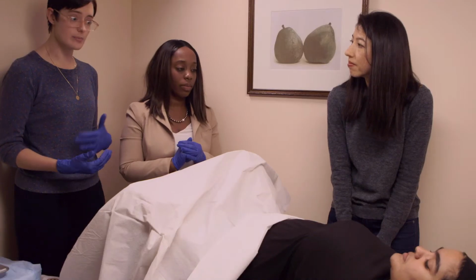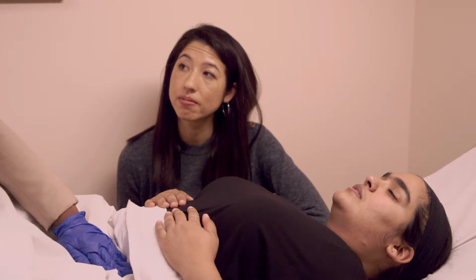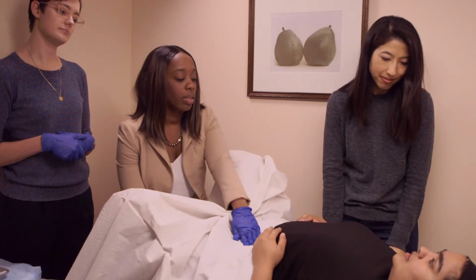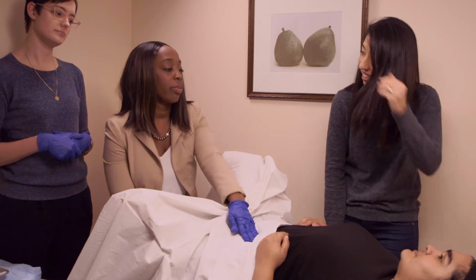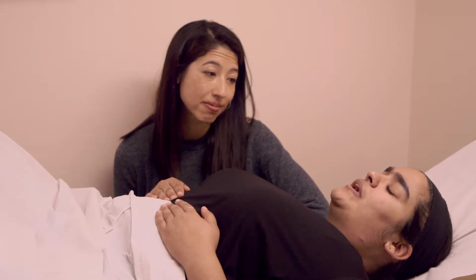So both Dr. Green and I are going to do an internal exam just to check the position of your uterus in preparation for the procedure. You're going to feel some cold gel in my hand and some pressure. How are you feeling? I feel okay. Okay, this feels like a small early pregnancy, so I don't anticipate any problems during the procedure. Oh, that's great. So I'm going to repeat the exam in preparation for the procedure. How are you doing so far? I'm okay. So you're going to feel my touch, some pressure.